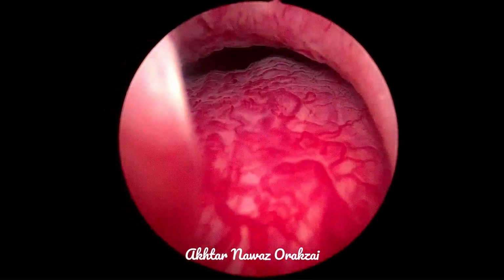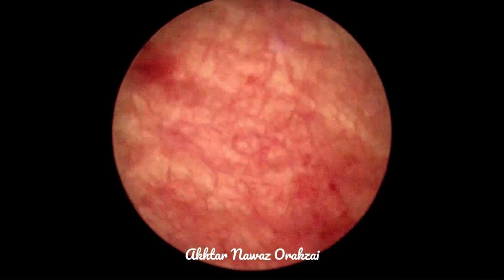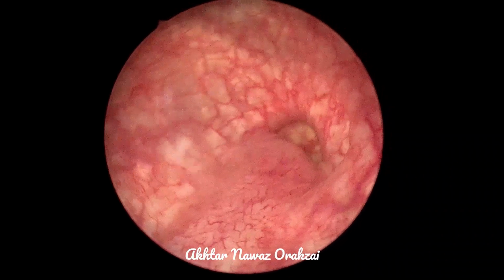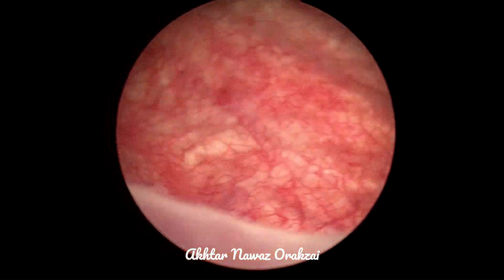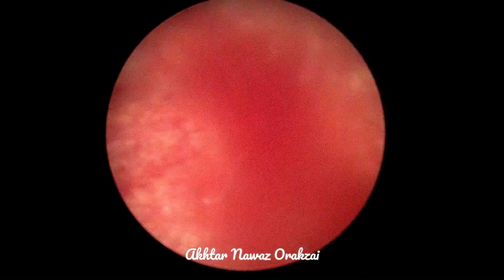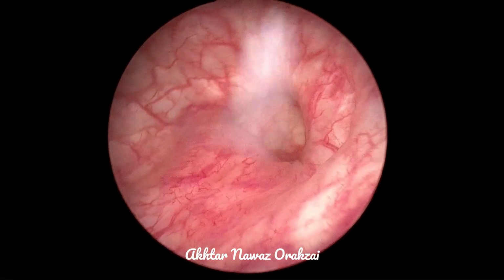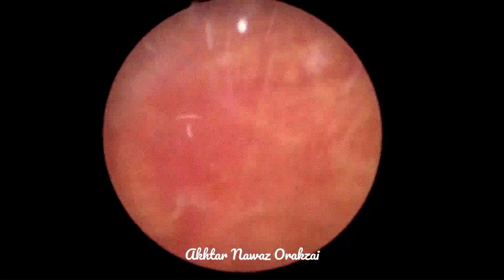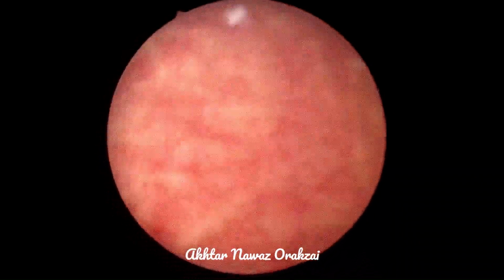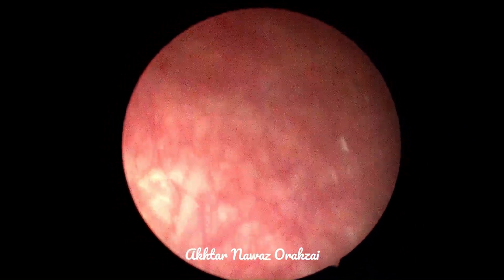This is the left lateral lobe and the right lateral lobe, and this is the median lobe. All these lobes are completely obstructing the bladder neck. On cystoscopy, you can see the left ureteric orifice, the right ureteric orifice, and a paraureteral diverticular formation on both sides, more so on the left side. You can see mild to moderate trabeculation of the dome of the bladder.